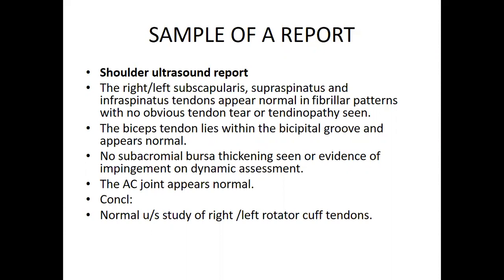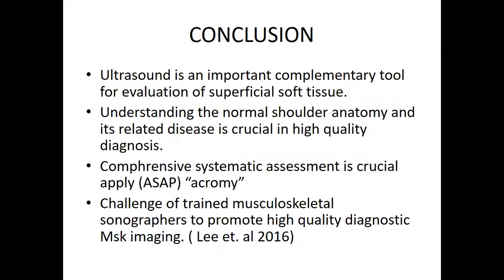So I think a report is key. There are other reports, abnormality reports that I can share. But this is what I wanted to bring out for a normal. Talk about things in a systematic way. Don't write too much, because when you write too much, you are not communicating anything. So make it simple, bring out the message within there.